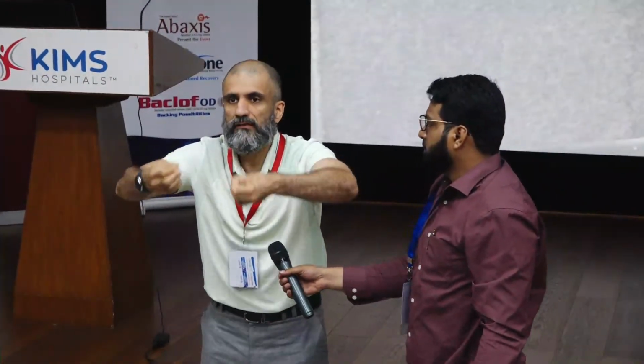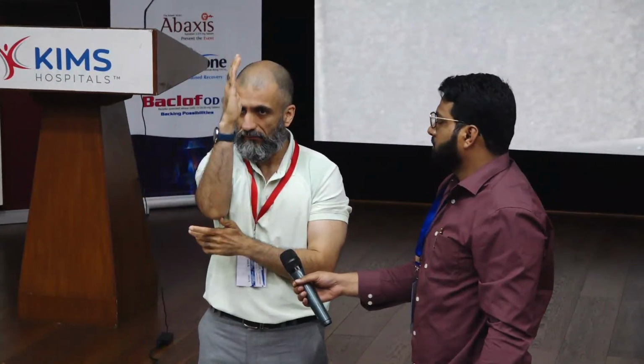I agree. So what we generally do is, as I told you, sir, this is the sacrum. The direction of the foramen is in the anterior posterior direction. So what we generally do is we put the C-arm right in the AP view. We go caudally. You will be able to see the foramina. So open it. Mostly you will have to do either a caudal tilt or a cranial tilt. That's it.